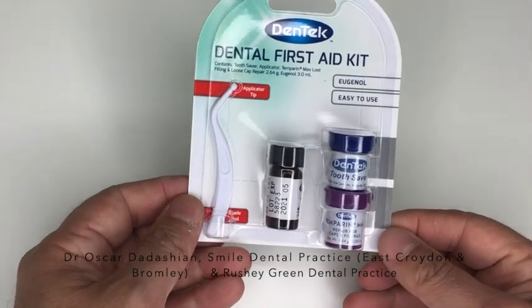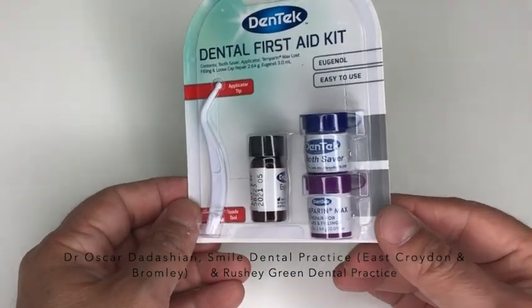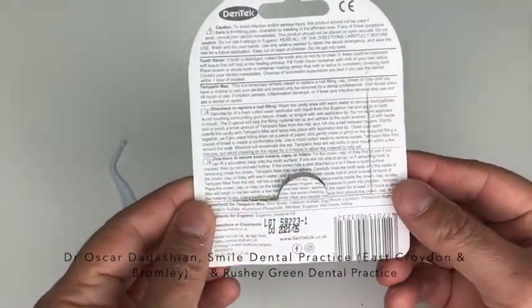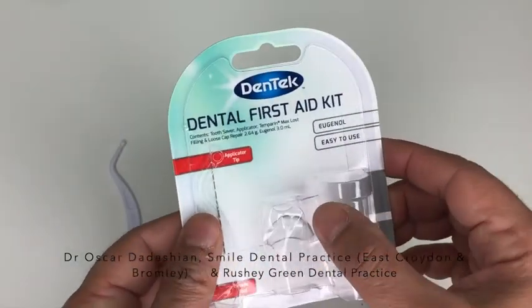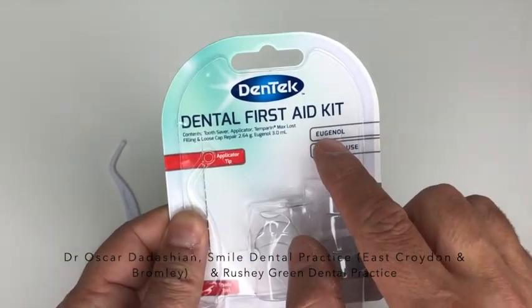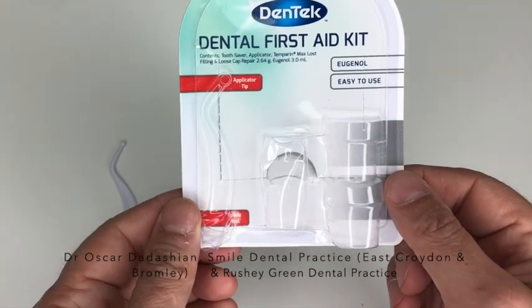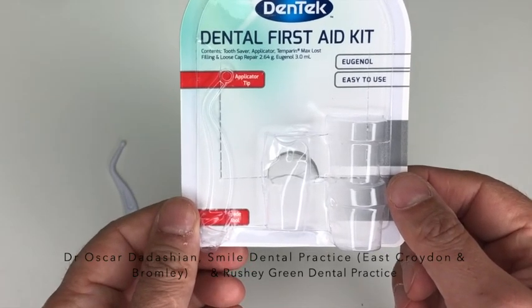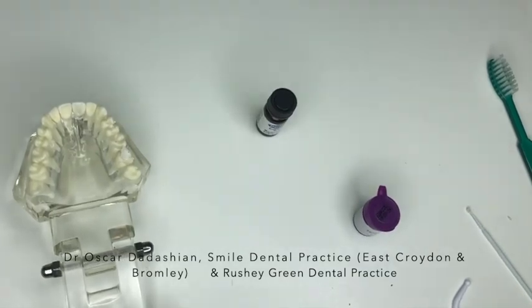So I picked up this dental first aid kit from Boots. It's very straightforward. Please take your time and read the instructions at the back. It's very self-explanatory and the instructions are very good. Please make sure if you're allergic to eugenol that you don't use this. If you have a throbbing tooth with a swelling next to it, that's the sort of tooth you don't want to use any temporary on top.